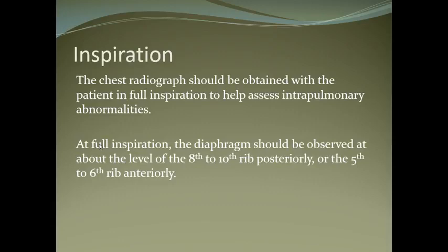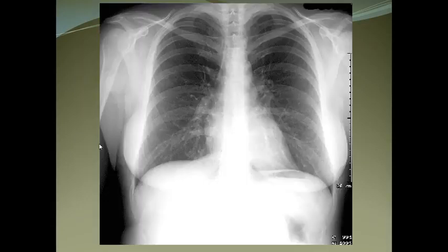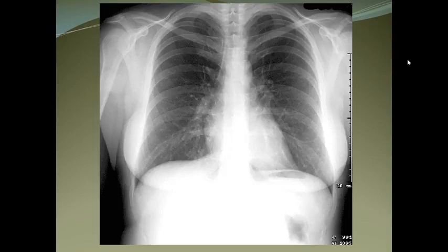At full inspiration, the diaphragm moves down and is roughly at the 8th to 10th rib posteriorly or the 5th to 6th rib anteriorly. Usually, the chest X-ray is taken in the PA (posterior-anterior) view. We only adopt the AP chest X-ray in children who cannot stand, like babies and neonates, and in very sick ICU patients.